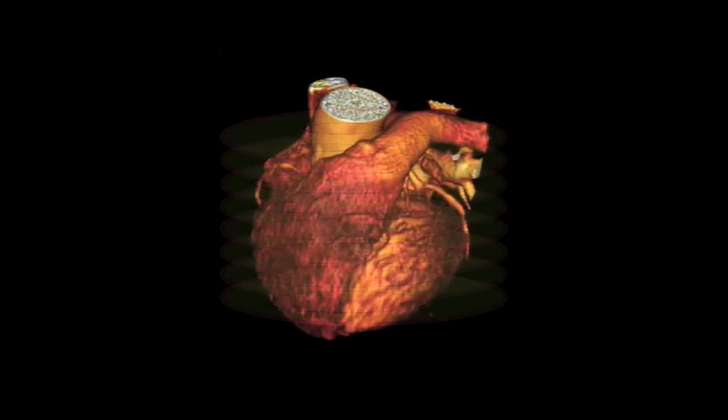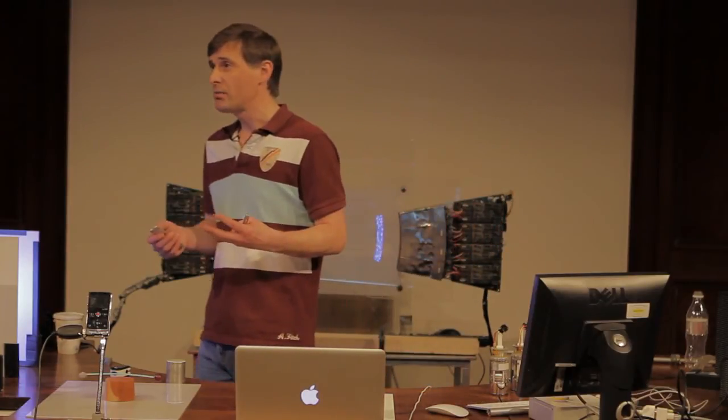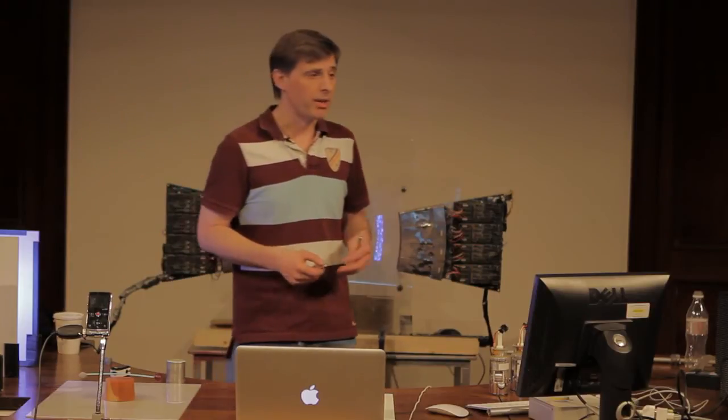And if we can build up one slice, then we can build up more than one slice. And that means that we can stack them up in our computer memory. And that means that we can build a fully 3-dimensional model of what's going on inside our bodies. And that's great, because that gives us the opportunity to build all of those pictures that you see on television. We can colour those pictures in. We can render them with our graphics card. We can fly through them. In fact, we can truly see inside the human body.